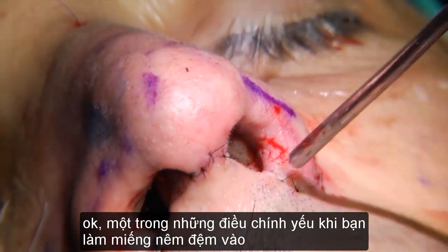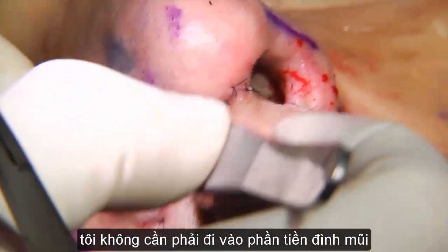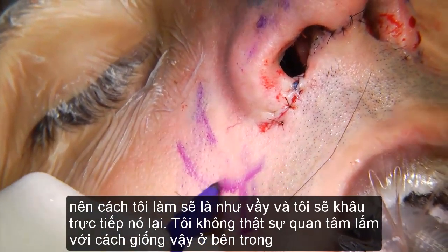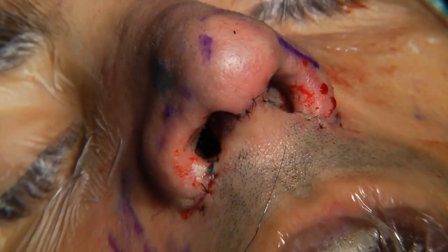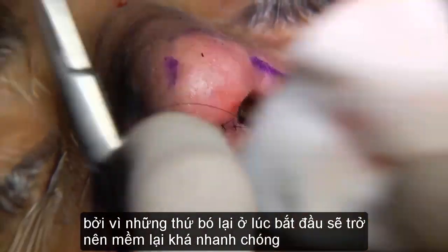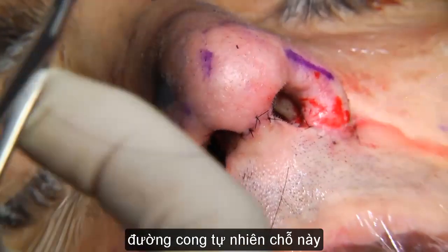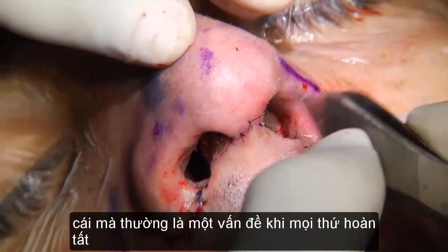All right, so one of the main things when you do this wedge resection, unless I have a need for it, I don't go in the vestibulum. So the way I do it is this, and then I just close it directly. I don't really carry this in the same way inside, because this mini bunching you have in the beginning will soften very quickly, and it will preserve the natural arch here, which is the problem when these things have been done rudely.